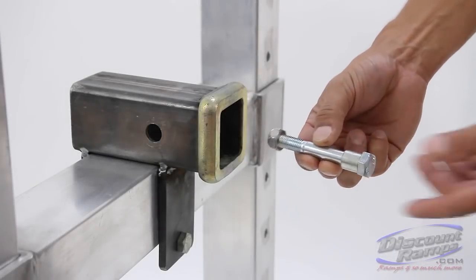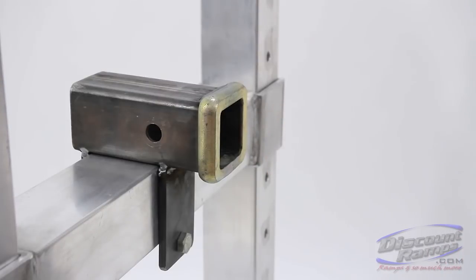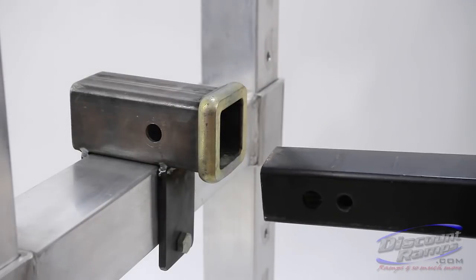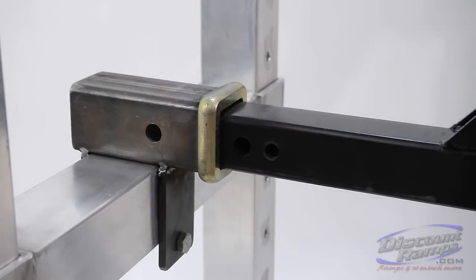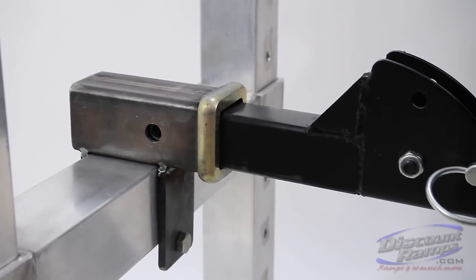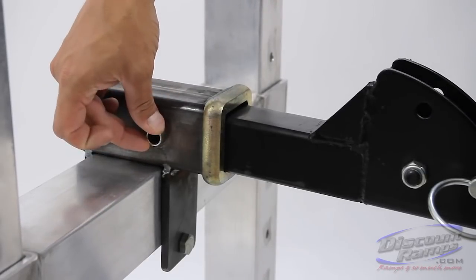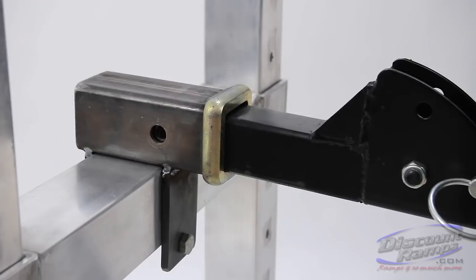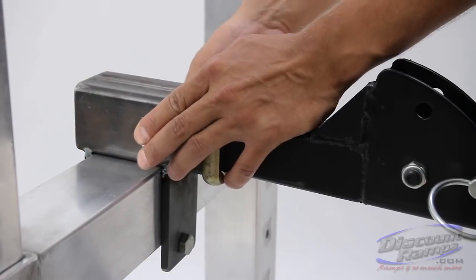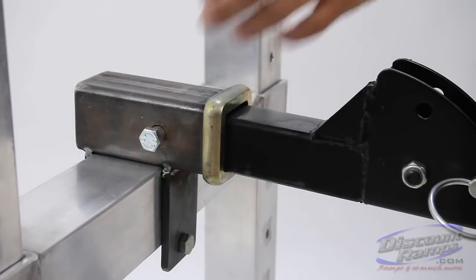The pinch bolt can also be used to secure the carrier to your vehicle. Align the half-inch hole on the hitch tube with the five-eighths inch hole on your vehicle's hitch. Next, insert the bolt into the metal sleeve and slide the pinch bolt into the five-eighths inch hole and fully tighten. The anti-tilt device and pinch bolt were designed to help reduce carrier wobble during transport.